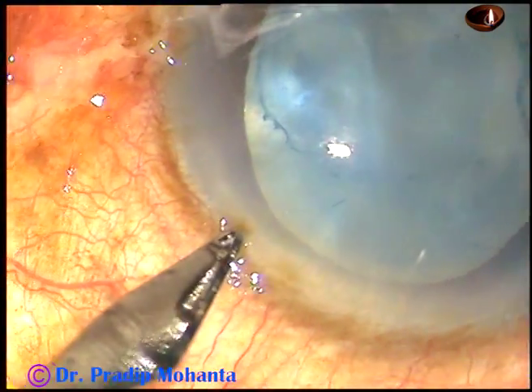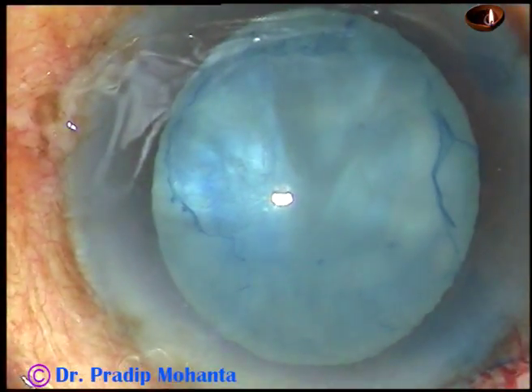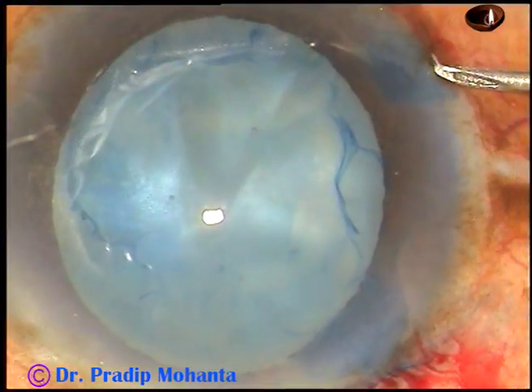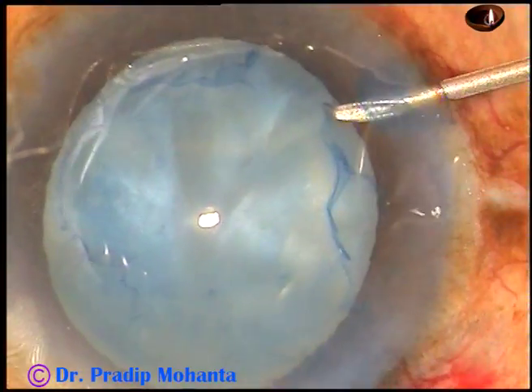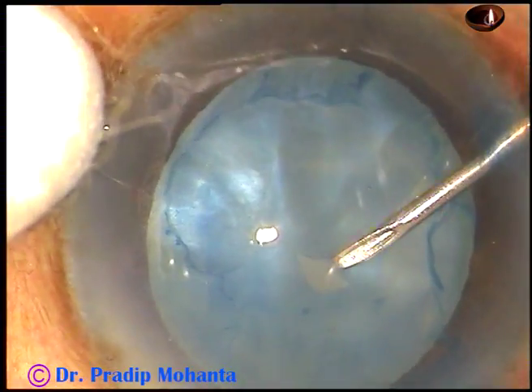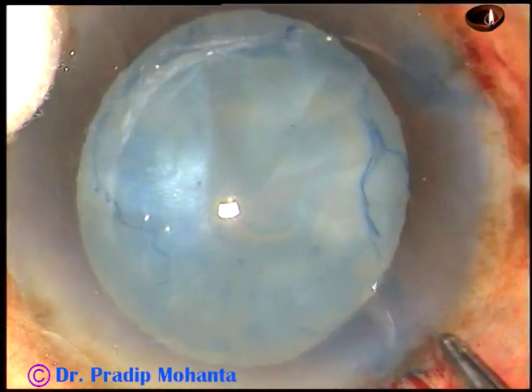Now I want to do capsulorhexis. This is a side port on the left side of the main incision. A 26-gauge bent needle is being introduced through the right side port. I make a puncture and make a C-flap, a carved flap.